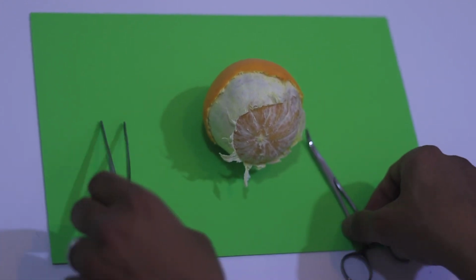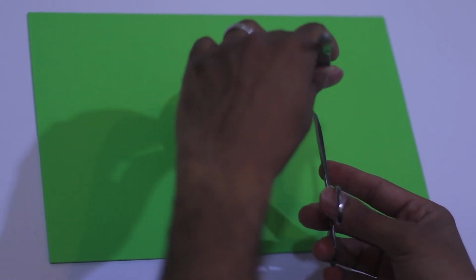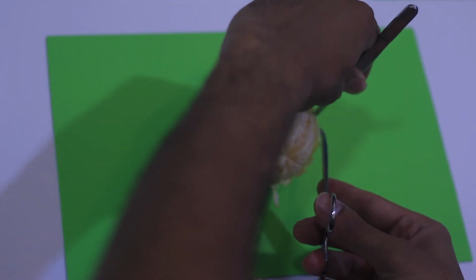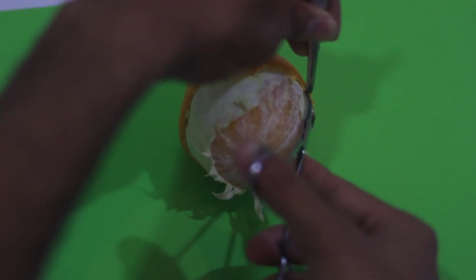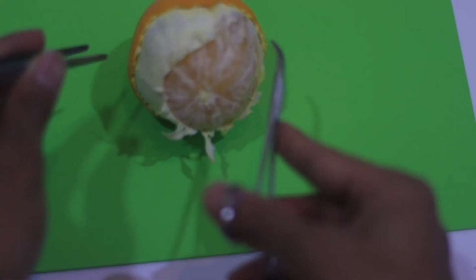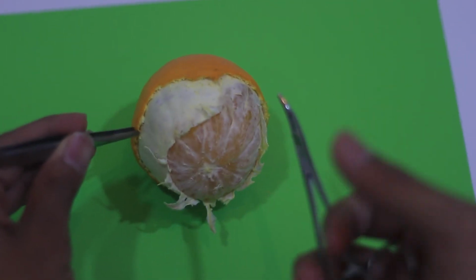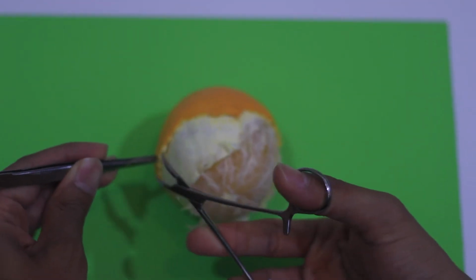This is a demonstration for a mass. We'll take the orange just like a mass, and we'll try to dissect from the right side. So you're holding the tissue from the right side and you're starting the dissection. So this is the dissection plane for the right side. Now we want to do it on the left side, so we just rotate it and we start the dissection in this side.